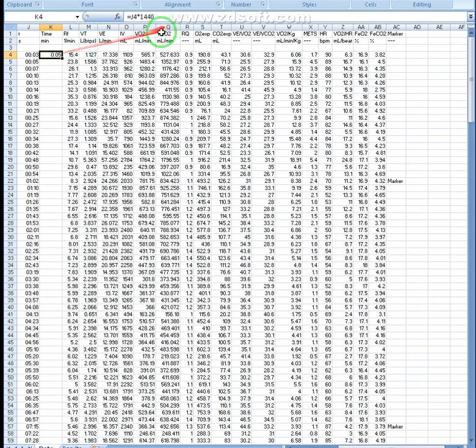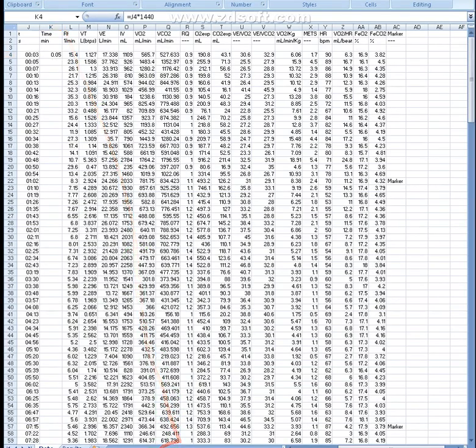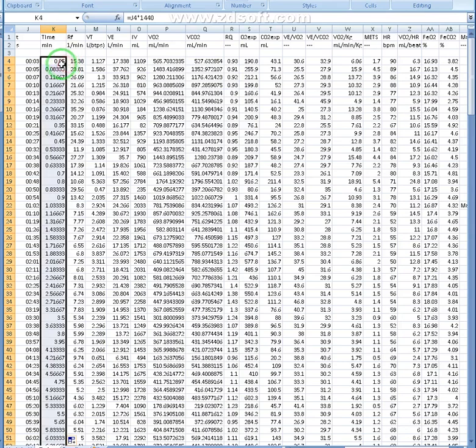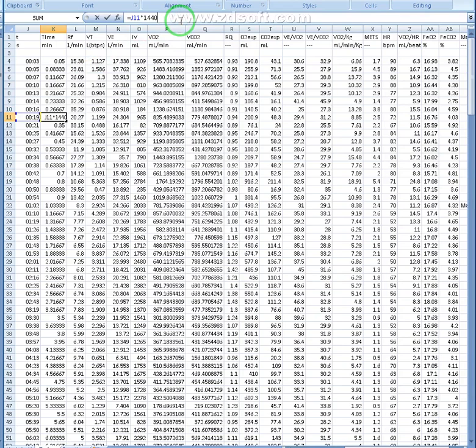However, we're going to keep it in minutes. So get back to 1440. And then once we got that, we can double click this and it will apply the time throughout. That 1440 multiplied by whatever numbers in the column next to it, on the same row.